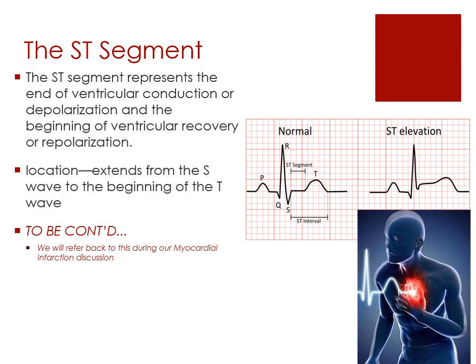And we look at that baseline because when we start looking at some of your problems, you're going to hear something called an ST elevation. Notice in the other picture here, with that ST elevation, that baseline is higher. That means that you have had some sort of heart issue happen, because it does not go back down to that baseline. Again, don't worry about the baseline. Just understand that there is a baseline, because you don't see the heart wandering all over the place. It really stays in a steady pattern. And that baseline will become important to you next quarter, and especially in critical care. So that's something to keep in your brain cells as you travel through your med-surg courses.